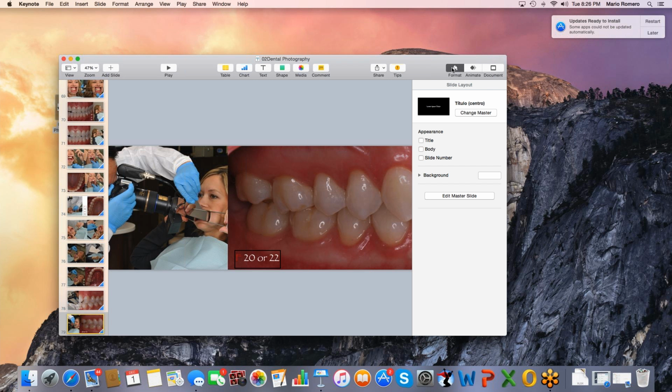The photos that we're taking right now, with the mirrors you're seeing there, are used by hundreds of students. We have 85 students per class, and we have junior and dental students in the clinic using these mirrors. So they are extremely used, and you can see that they are still in good quality. We do change them when we need to, but not very often. So hopefully I did answer your question. Did I answer your question with this?